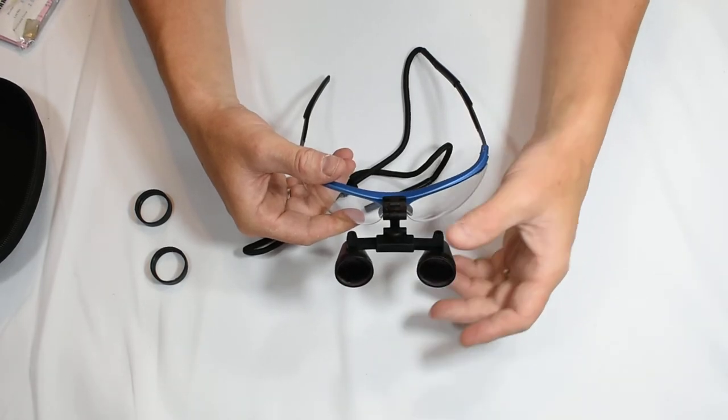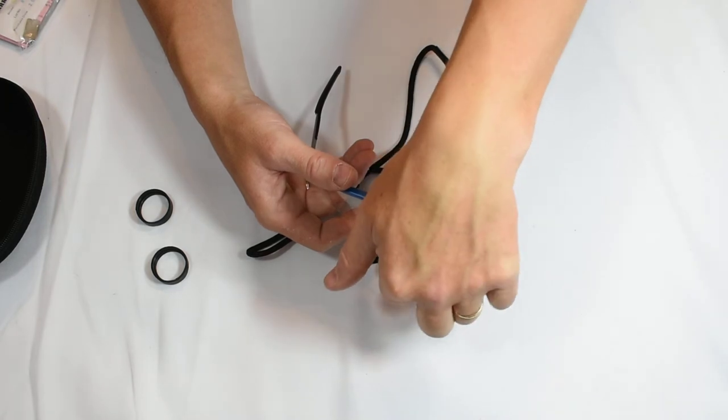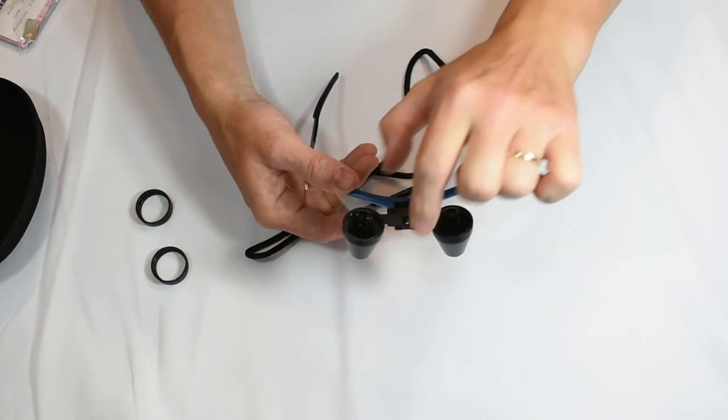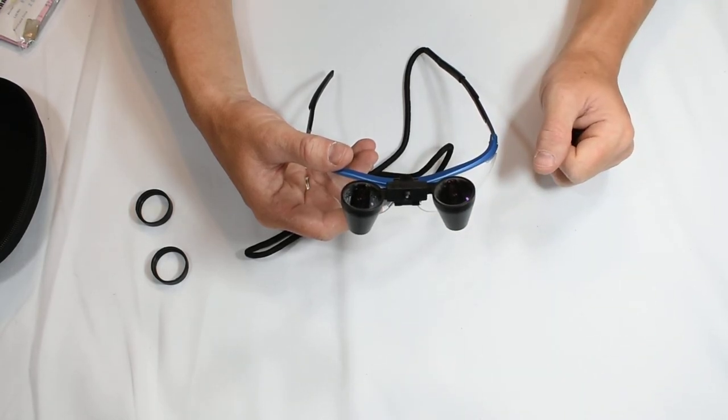Now if I want to look through with magnification then I just flip the loops down and I can see directly through them, but if I no longer need magnification but I still want to wear my safety frames I can flip the loops up out of the way.